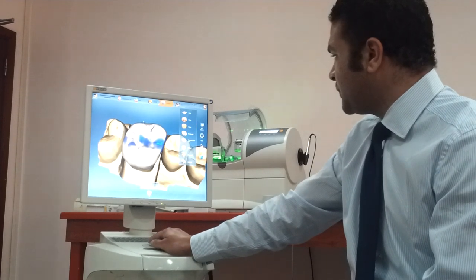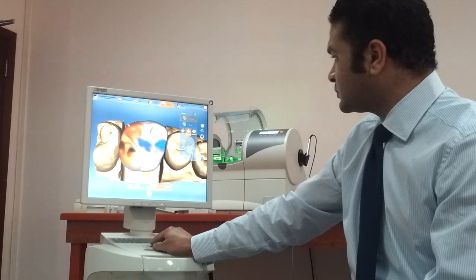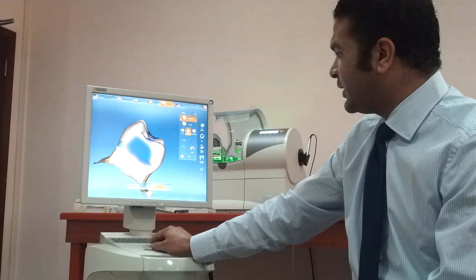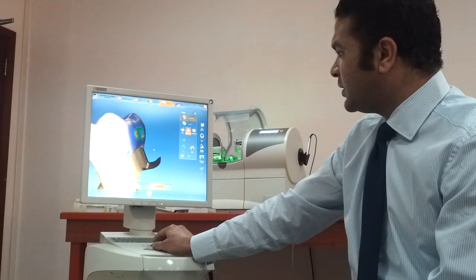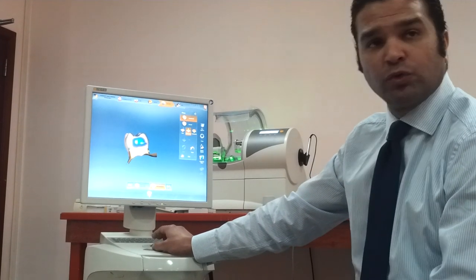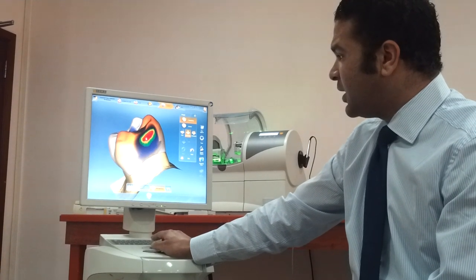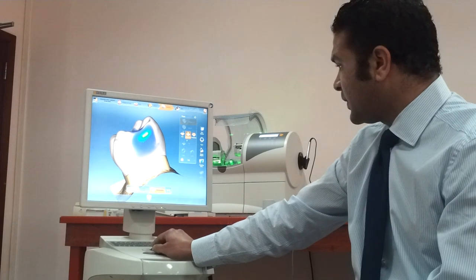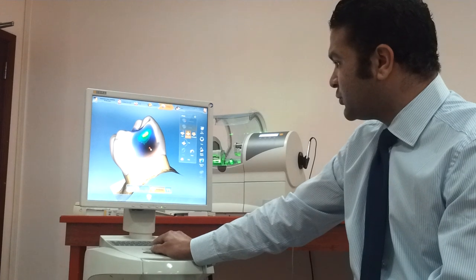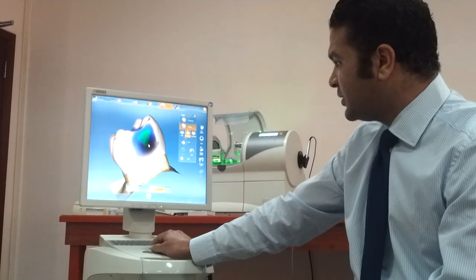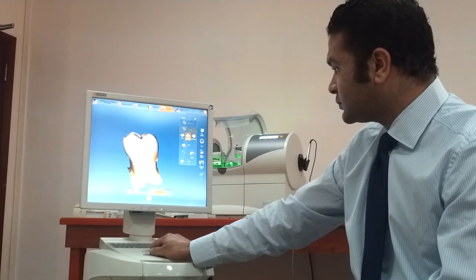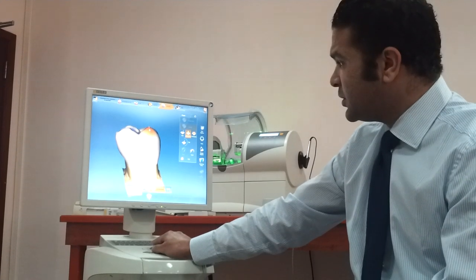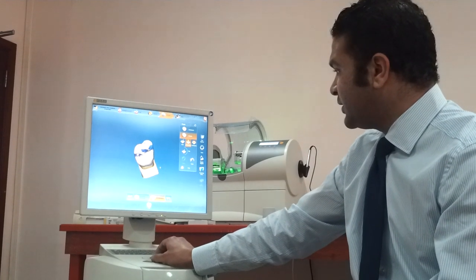You can shape your restoration and adjust contacts. To check contacts, trim the view to see proximal contact from the side — you need a broad contact area to avoid force concentration. The software warns when a contact is too strong. You know that posterior tooth contacts should be more or less in the mid area, not on the very high buccal area. You can also enhance your cusps if needed, depending on your occlusal clearance.